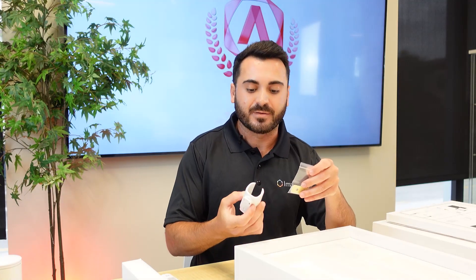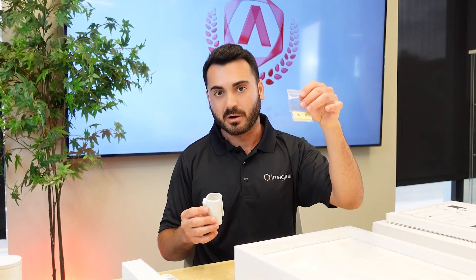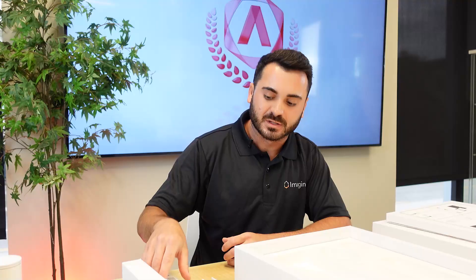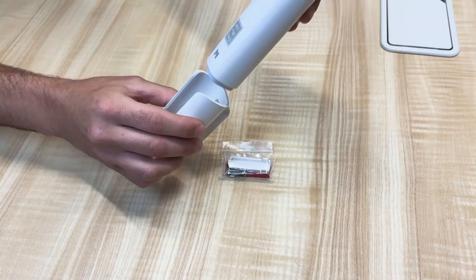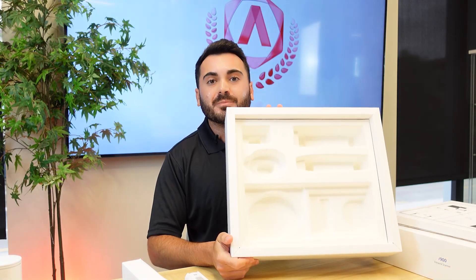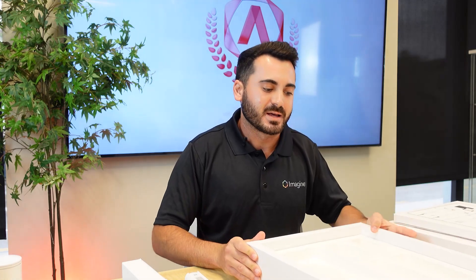Lastly, we have our wall mount and a pair of screws. The purpose is to be able to mount the scanner on the wall in a vertical position for the user to use. And that's pretty much everything we have in the box. Medit has very much simplified their packaging and design, which I think is a great idea.